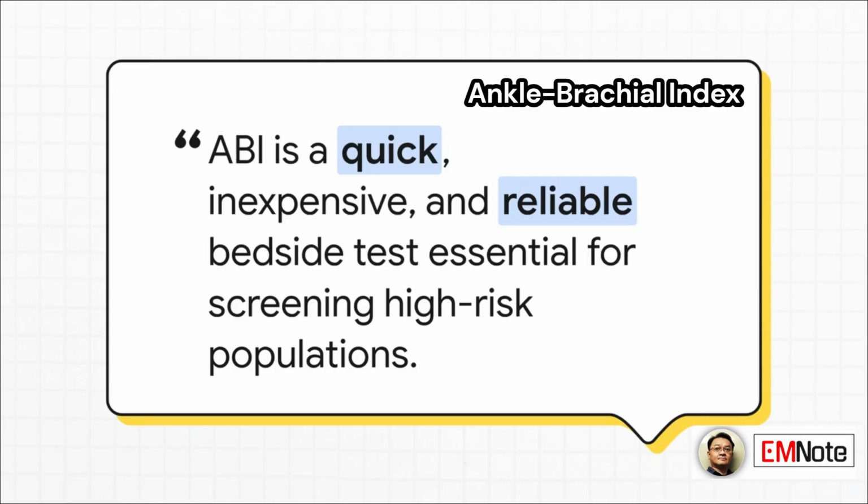To sum it all up, the Ankle-Brachial Index is a quick, inexpensive, and reliable test you can do right at the bedside. It's an absolutely essential tool for screening those high-risk populations and getting objective data to guide your treatment.